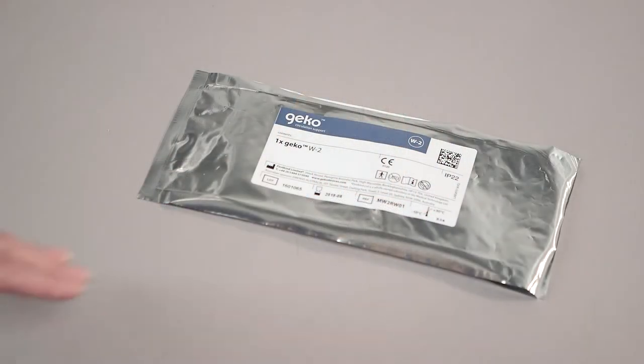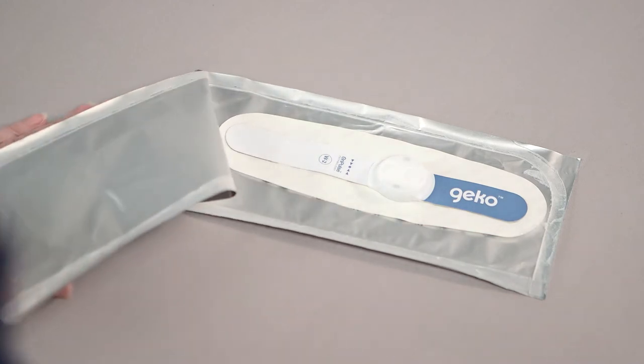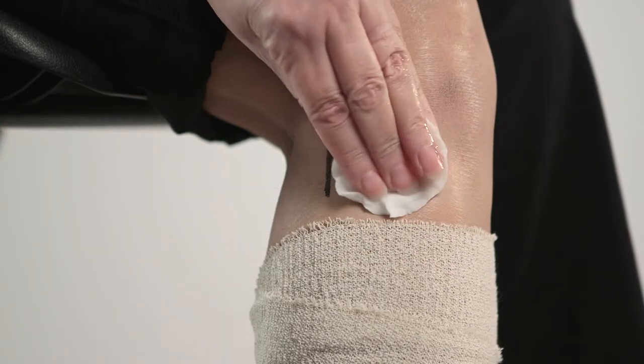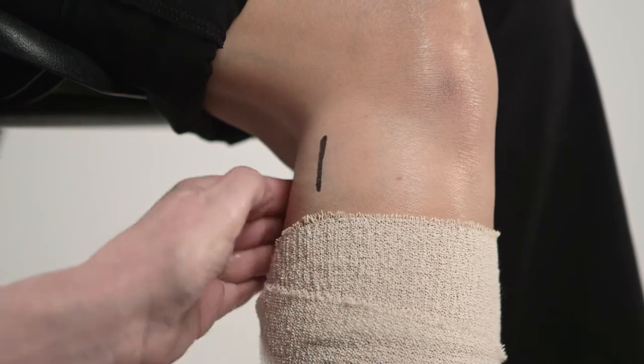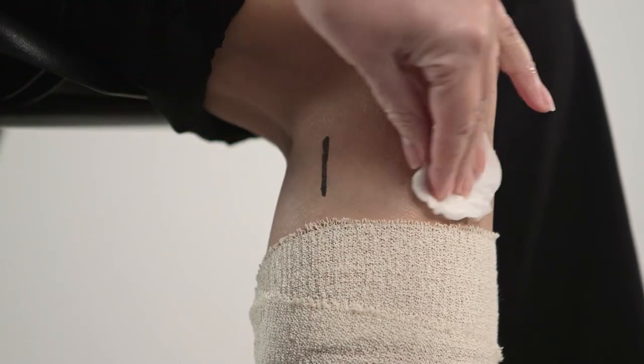To open the device pack, simply peel the two ends of the foil pouch apart. Inside, you will find one Gecko device fixed to a reusable backing card. Using soapy warm water, gently wash the area where the device is to be fitted, removing moisturizer if present, and rinse with clear water and pat dry. Do not apply moisturizer, as the device will not stick.